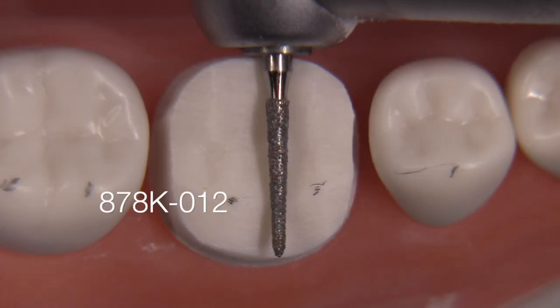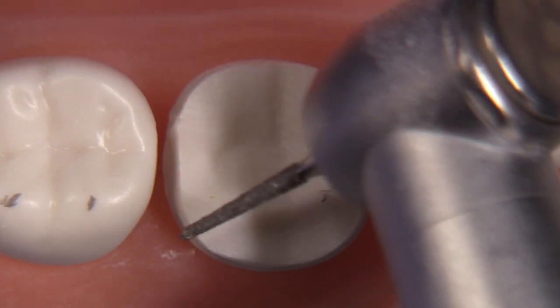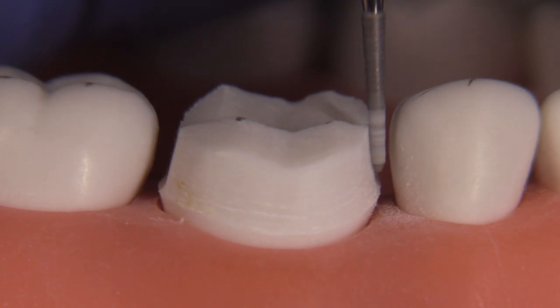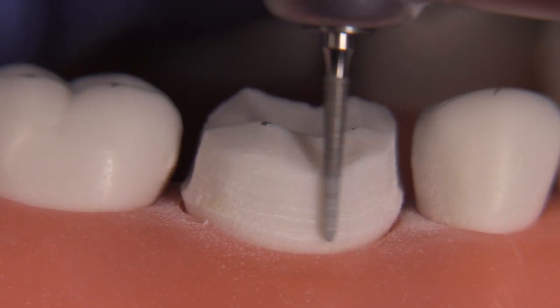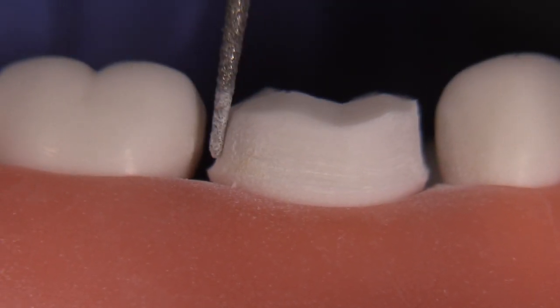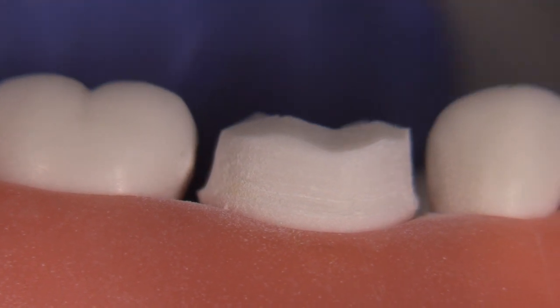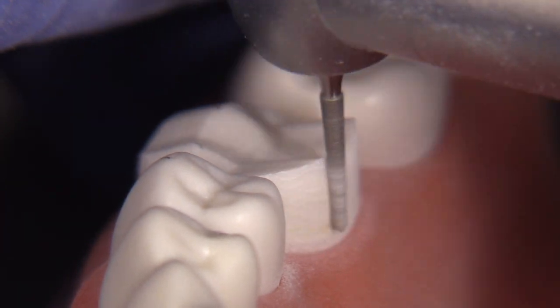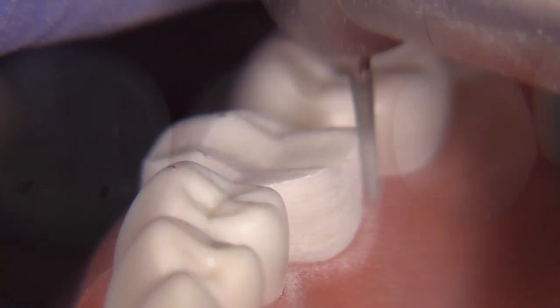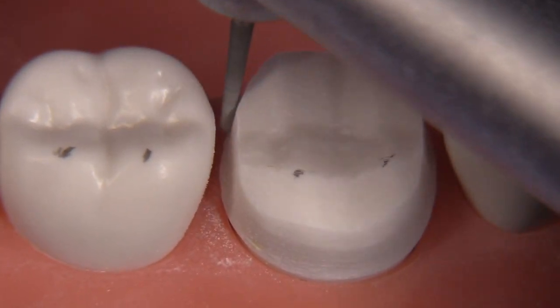It kind of looks like a mess right now with a lot of irregularities on the axial walls, so let's equalize the taper and make it smooth all the way around. For that I'm going to use the 878K012 again. I'll go around and equalize the taper — correcting areas that are over-tapered and areas that are under-tapered. I may need to lower the finish line slightly so it's more uniformly above the tissue, smooth off transitions to avoid sharp edges, and upright any over-tapered walls as I lower the finish line.